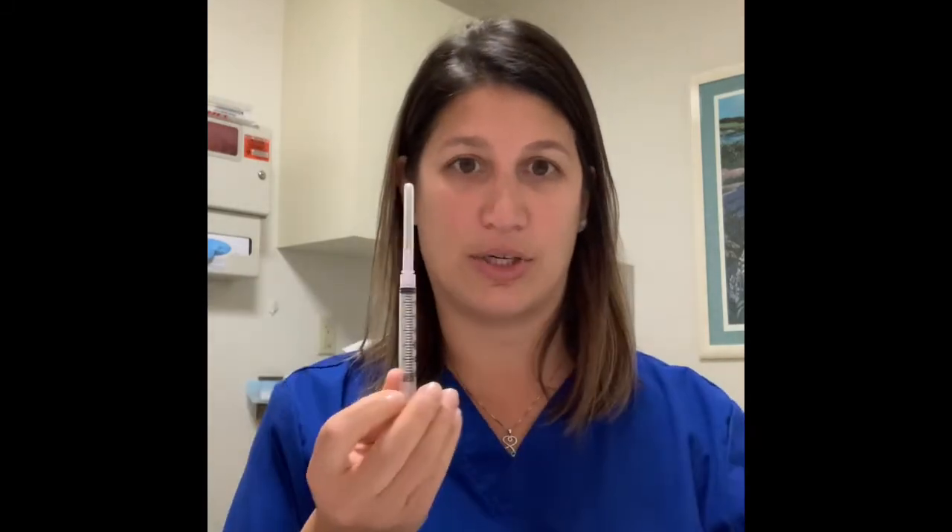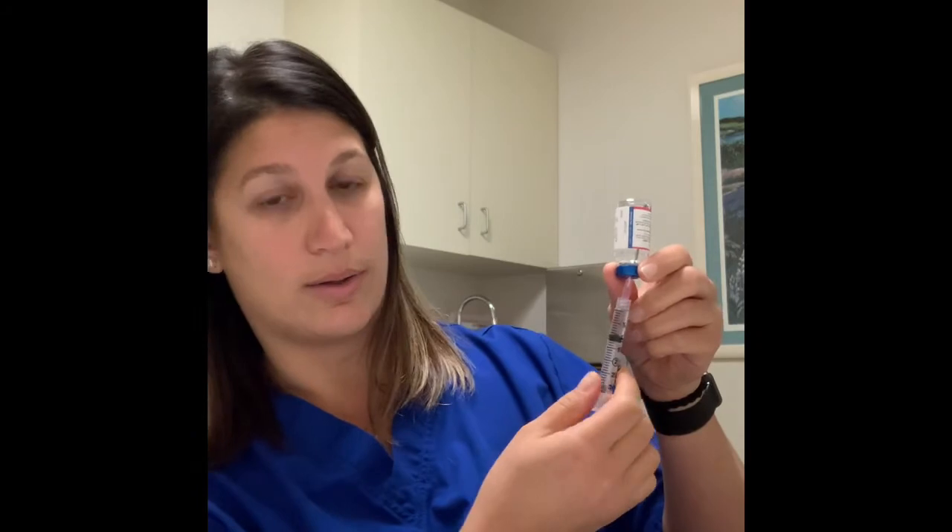Take the syringe out and draw up one cc of air. Uncap it, put it into the progesterone vial, turn it upside down, inject the air in, and draw out past one cc. Your dose for this medicine is one cc, but because you draw out air and micro bubbles, draw past one, give it a little flick, and then push back up to one cc.